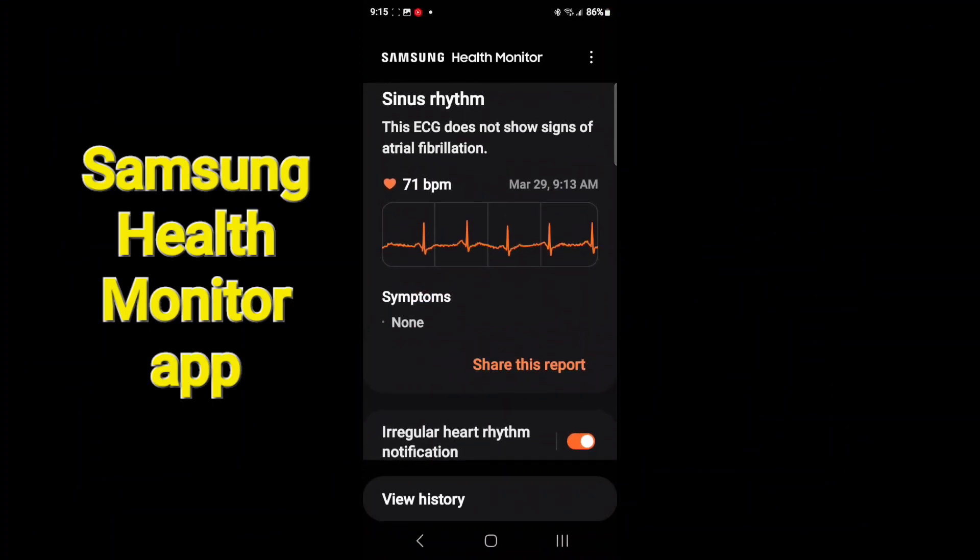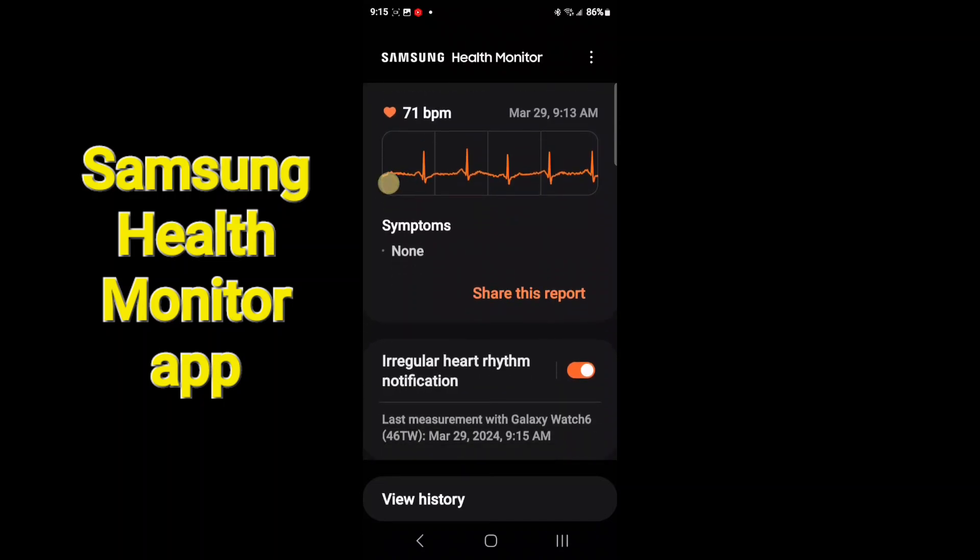This is a recording I did a little bit later — I finally got back to sinus rhythm after taking a hot shower. What you can see here is that it'll constantly check your heart rhythm. This notification at the bottom is irregular heart notification, and when you're sleeping is a great time to catch it.